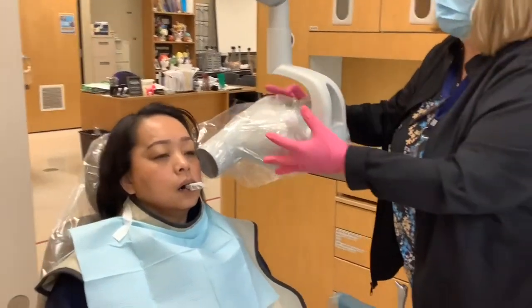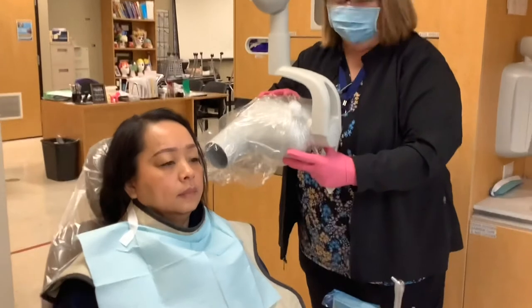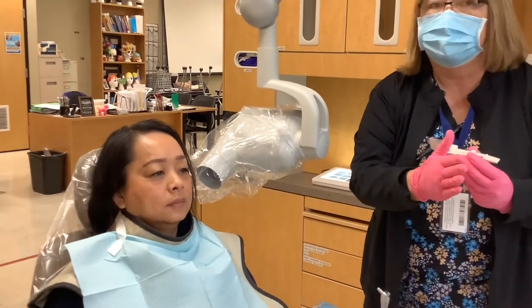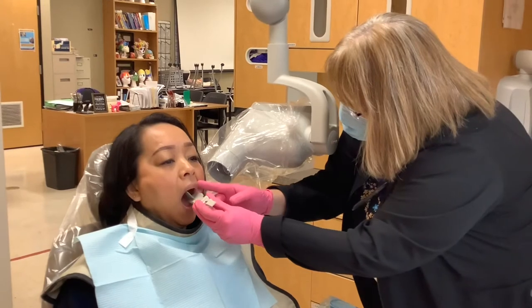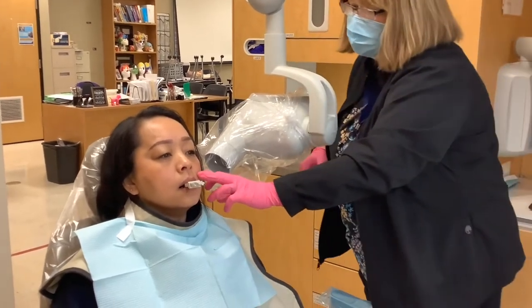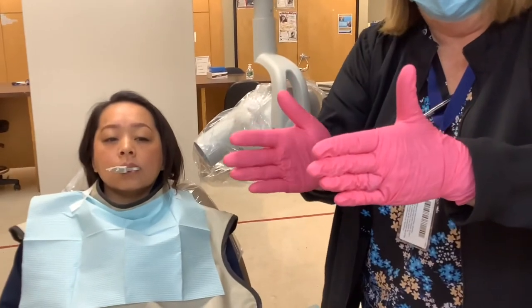That's my molar shot. For my bicuspid shot I'm now going to 30 — what's the song? 20, 30. I'm going as far forward as I can with my x-ray film and holder. I want the cuspid distal in this shot. My film and my cone head have to go in the same direction or I'll have overlapping. If I'm coming at the wrong angle I'll have overlapping and my contacts won't be open. My film is here, so my x-ray head has to go like this.